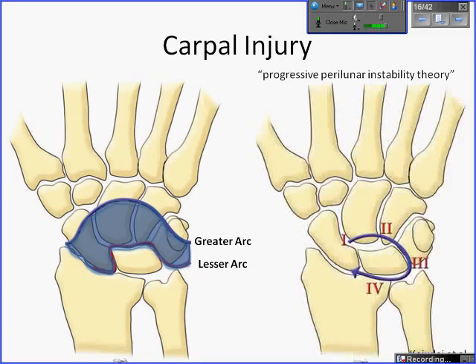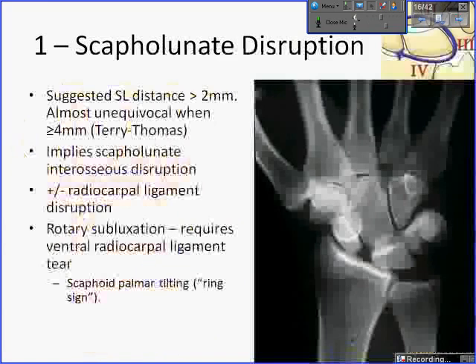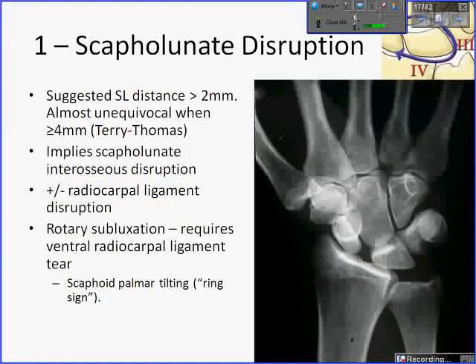The lesser arc injury pattern is also known as the progressive perilunate instability theory, where in a clockwise fashion there are sequential ligamentous injuries about the lunate. Stage one involves injury in the region of the scapholunate joint. Stage two involves disruption of the lunocapitate alignment. Stage three involves disruption of the triquetrolunate ligament. Stage four involves complete ligamentous disruption about the lunate, and the lunate dislocates. All of these are unstable patterns.